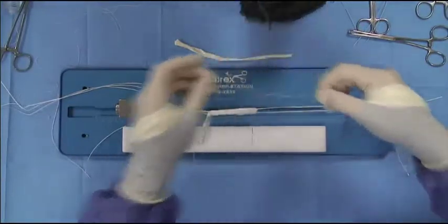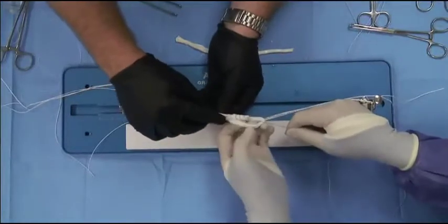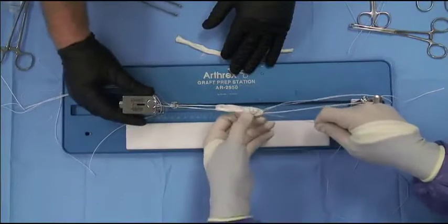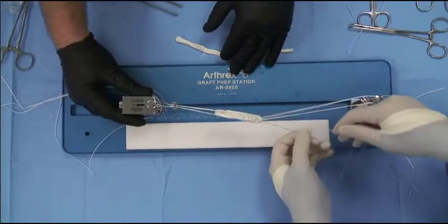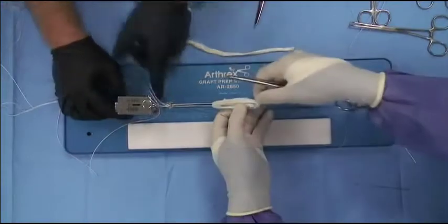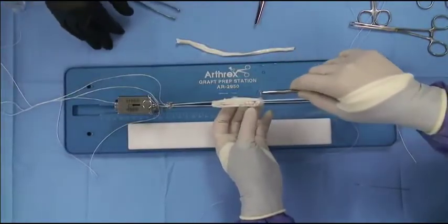And the next trick I like to do is cut the end of the suture, but save the metal Keith needle. So we pass those sutures back through the end of the graft, taking care not to touch our button. We'll take the tension off just there so I can pull this all the way seated. If you can see, we have 1, 2, 3, 4 strands.